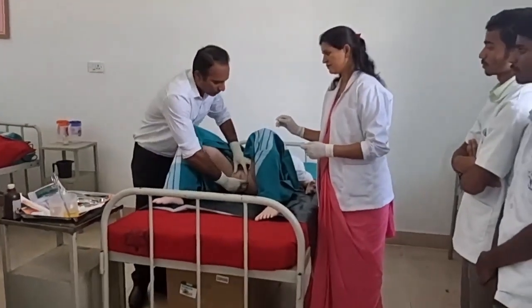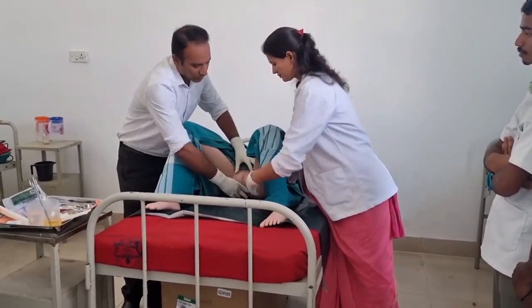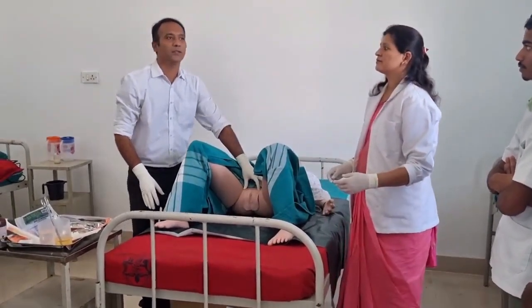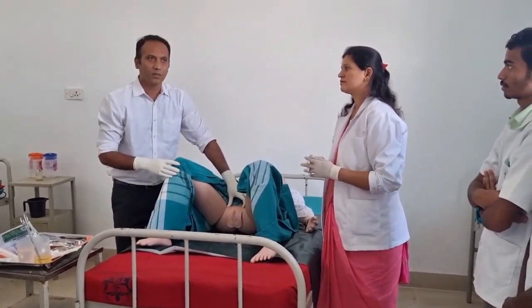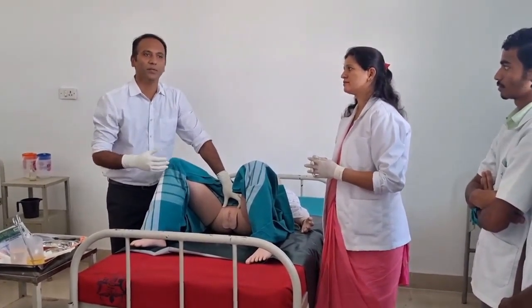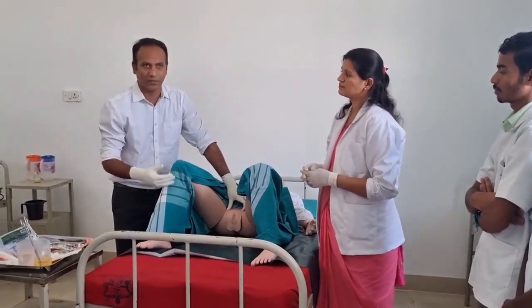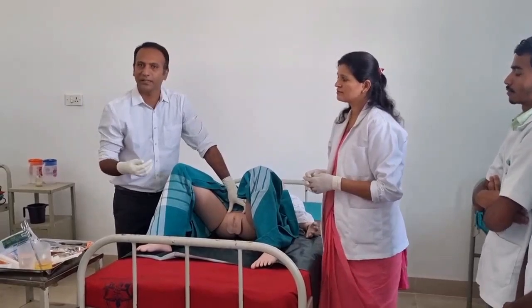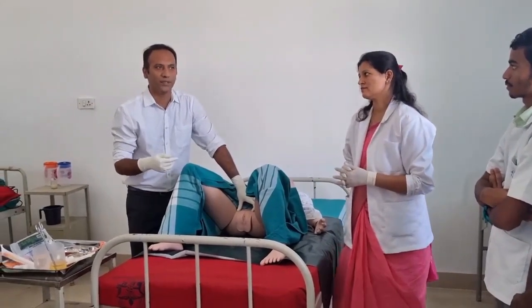Coming to the procedure. First, we should know the length of the urethra in females. It is around 2.5 to 4.5 centimeters. Take 4.5 centimeters. When inserting the tip of the catheter, you will insert up to 5 centimeters.